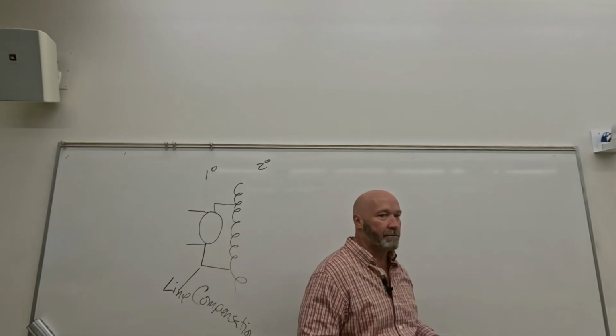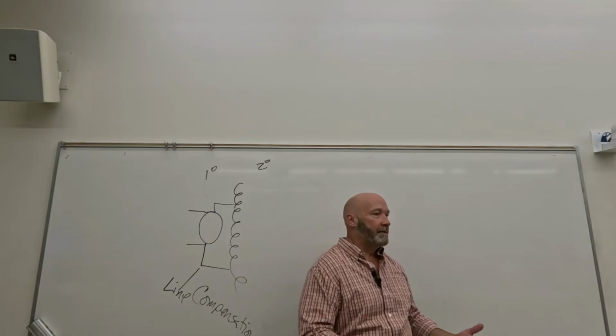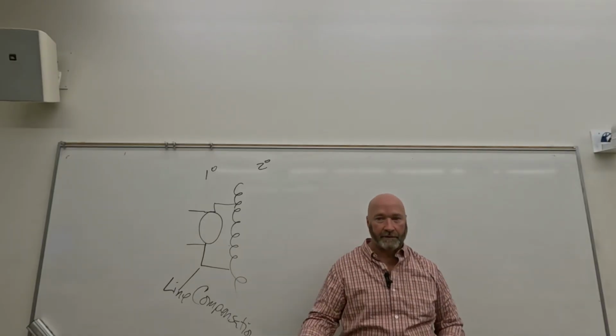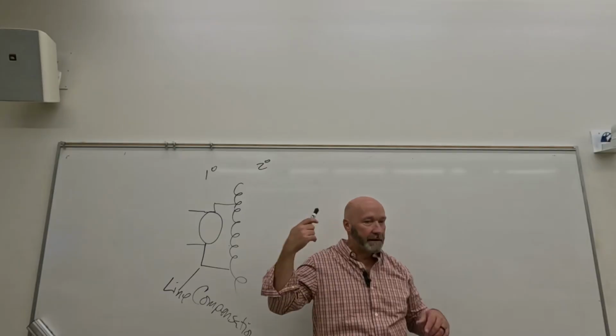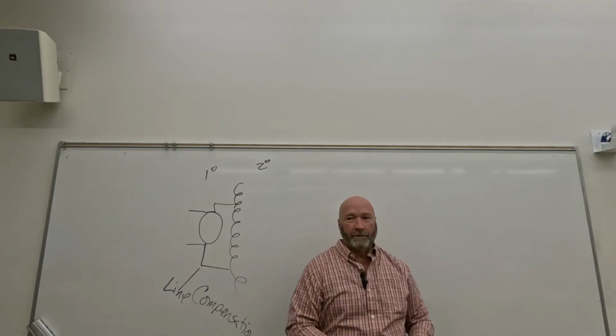And inasmuch as we're taking a low voltage and making high voltage, it generates that. But a generator is generally something that generates electricity. All right, so windmills. You're taking mechanical energy and you're making electric energy. That's a generator, okay? So don't confuse the two.